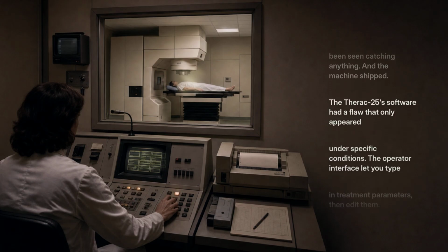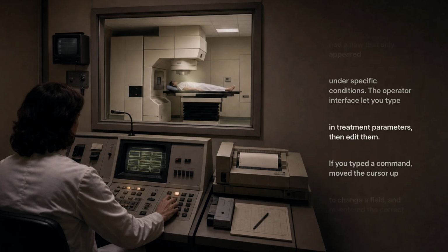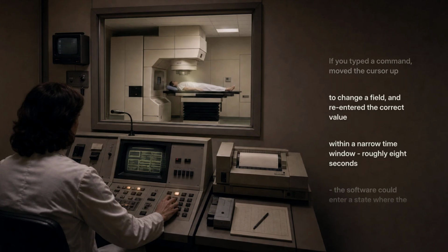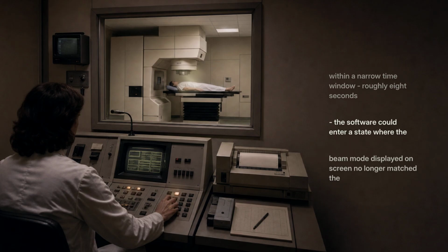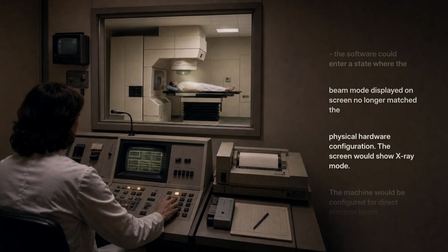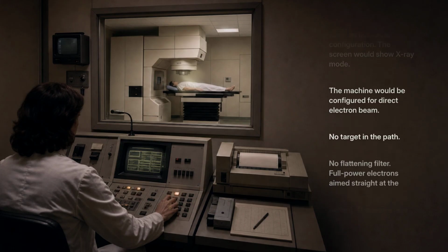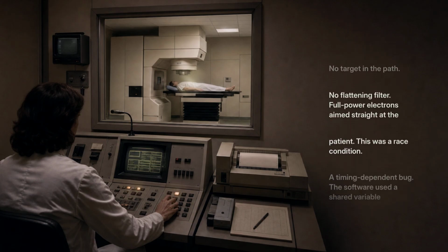The Therac 25's software had a flaw that only appeared under specific conditions. The operator interface let you type in treatment parameters, then edit them. If you typed a command, moved the cursor up to change a field, and re-entered the correct value within a narrow time window, roughly 8 seconds, the software could enter a state where the beam mode displayed on screen no longer matched the physical hardware configuration. The screen would show X-ray mode. The machine would be configured for direct electron beam. No target in the path. No flattening filter. Full power electrons aimed straight at the patient.